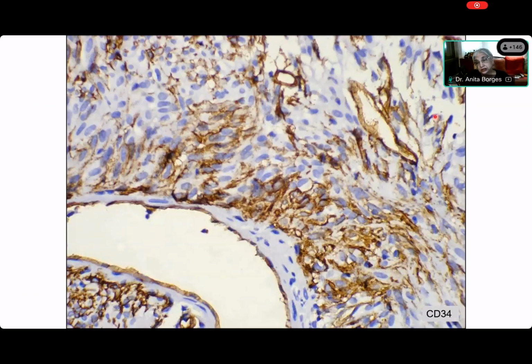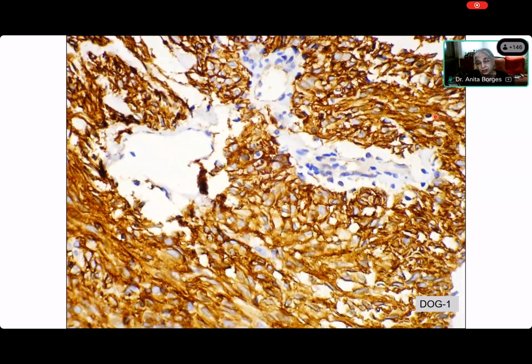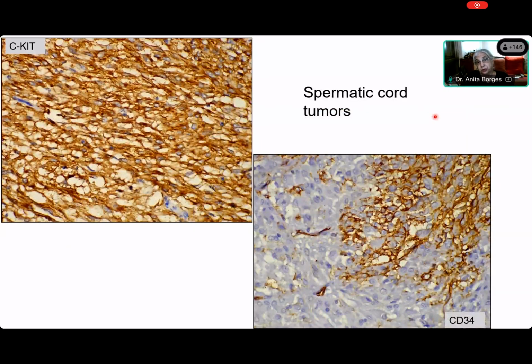So now what should we be doing? Somebody in the chat box, Vishal, says do CD117. And Vishal is absolutely right. Here is C-KIT, which is CD117, and here is DOG1, whereas CD34 was very focal in that tumor. So we went back to the spermatic cord tumor and did CD117 and DOG1 on that tumor, and you see that they are both positive. CD34 is also positive in this. So here's 34 and there is C-KIT on that tumor.